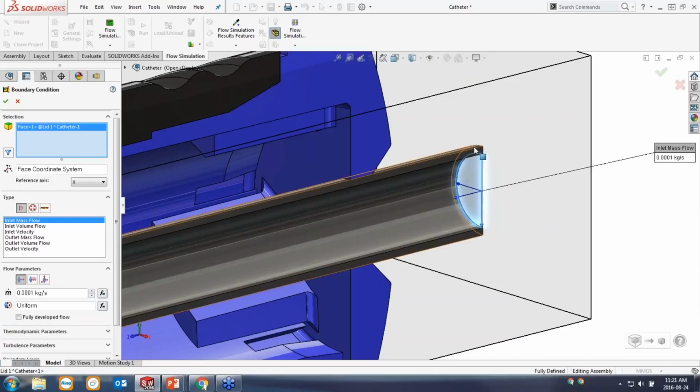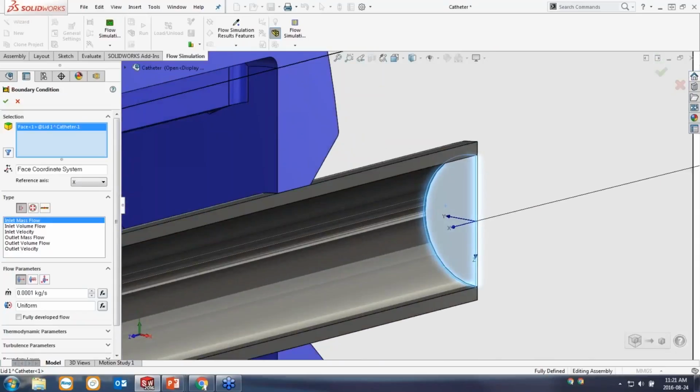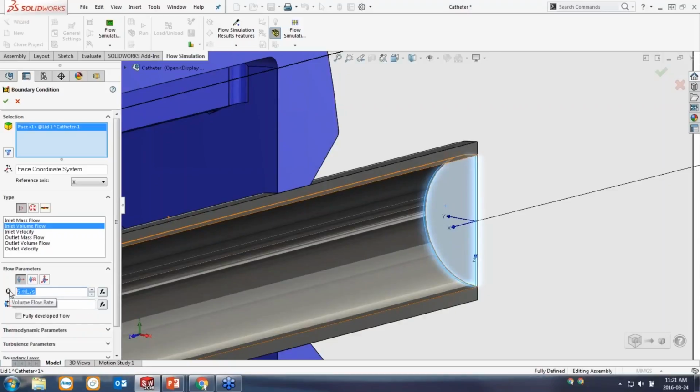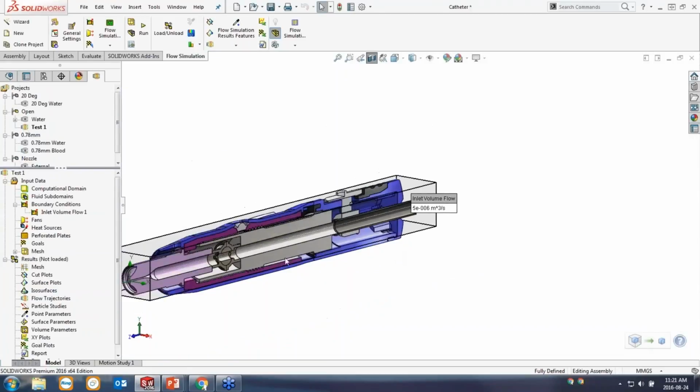Fortunately, there's an automatic lid creation tool in Flow Simulation, so you can simply select the face and it drops that circle in there for you. Of course, even if it wasn't a nice shape like that, I'm sure you guys can model a disc like that, no problem. We've got an inlet volume flow here, and I'm simply going to type in that I want 5 milliliters per second. I left my units on meters cubed, so I'm just going to type that in as 0.000005 meters cubed per second, and that'll be my 5 milliliters per second.